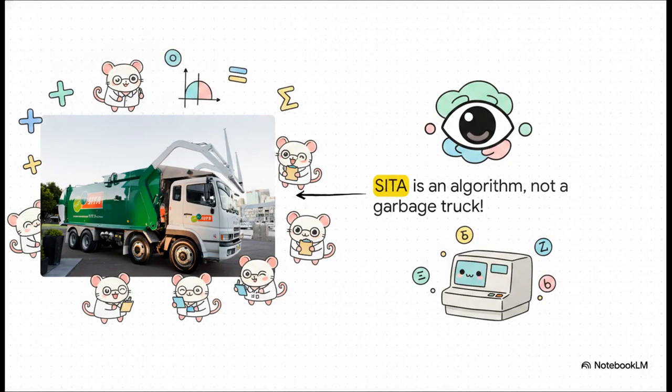Moving on to Section 2, SITA, ZATA, and GATE. Those exact probabilistic ideas we just talked about gave birth to some of the absolute most important innovations in our field. Meet SITA. And yeah, while it hilariously shares a name with an Australian waste management company, the Swedish interactive threshold algorithm is definitely not a garbage truck. SITA was built for the Humphrey field analyzer, and it literally revolutionized everything. It relies on maximum likelihood estimation and Bayesian probability.